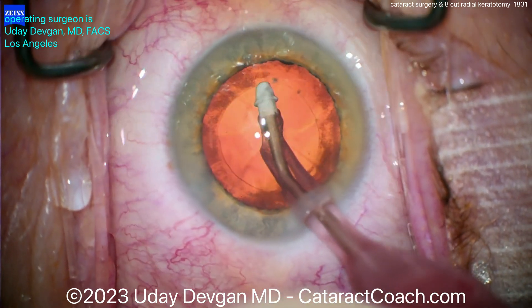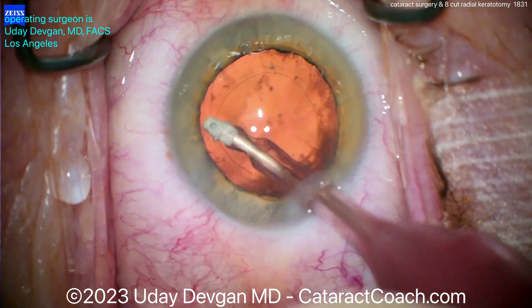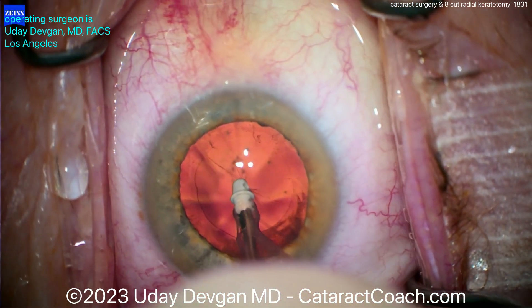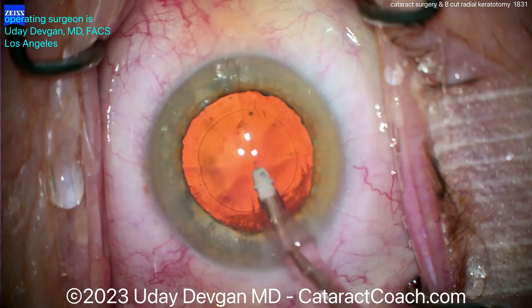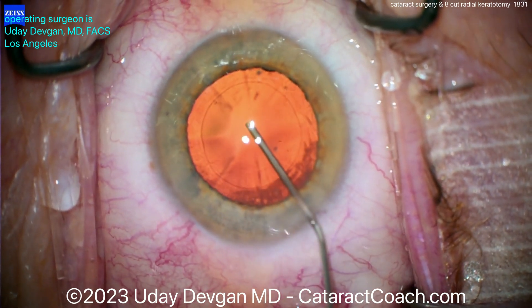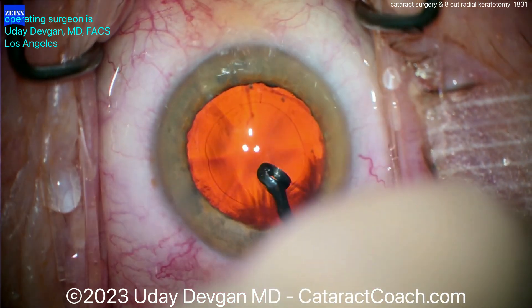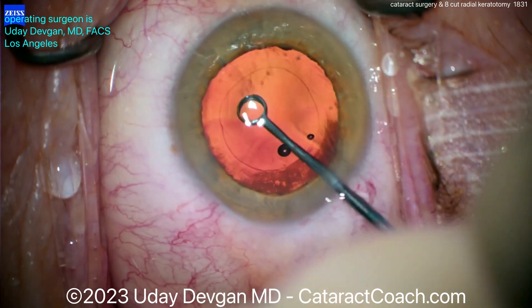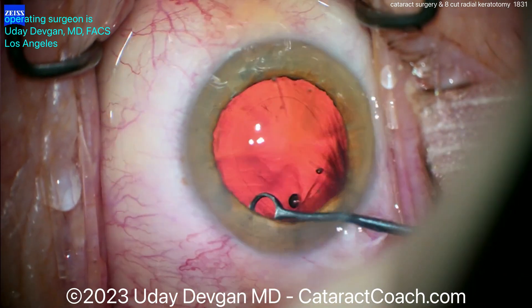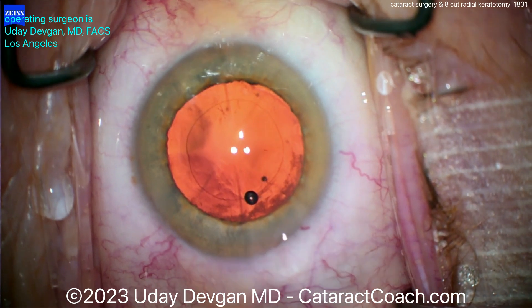Nice and easy. When you make these incisions, a diamond keratome is my preferred instrument — you can use a steel blade, but I prefer a diamond. Cleaning up the capsule bag nicely, but be very cautious. In some RK patients we do use a monofocal toric lens, and they can do very well with a toric. You just have to make sure their astigmatism is symmetric, stable, and regular — not irregular. We'll polish the capsule bag a little bit; there's a little sub-incisional lens material there. Get as much as you can, but be gentle. First, do no harm, and it'll clean up pretty nicely.